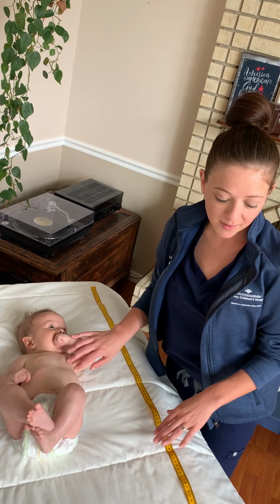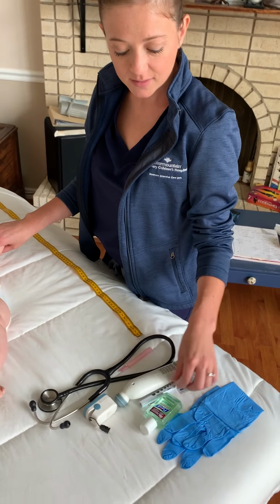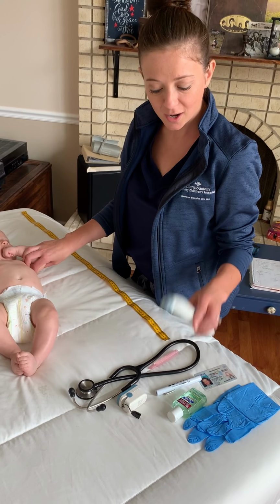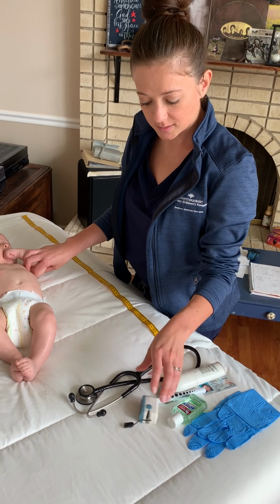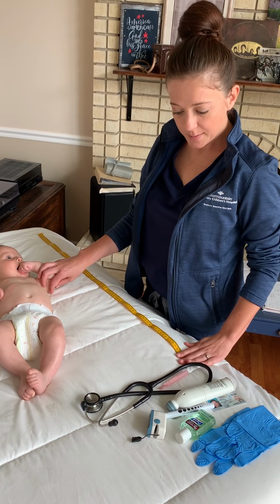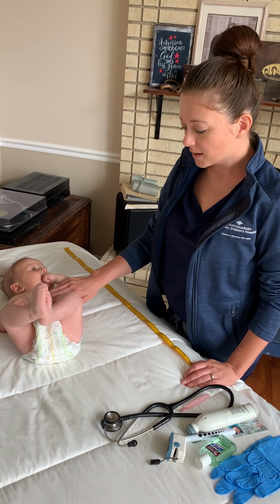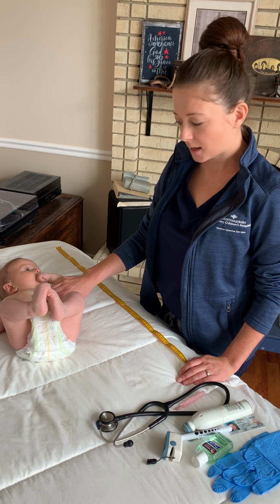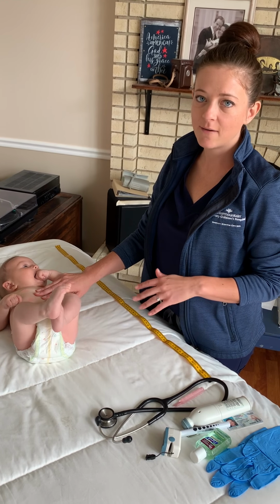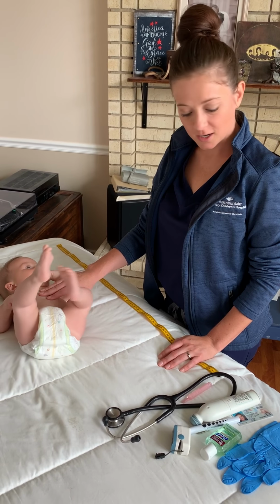So just to go over the equipment I have today. I have hand sanitizer, gloves, a pen light, a thermometer, a pulse ox, a stethoscope, and just a measuring tape. So that's just to do my baseline assessment on the baby. The only things I'm missing are an ophthalmoscope and a blood pressure cuff because I don't have an infant-sized one here at home. So we will get started.